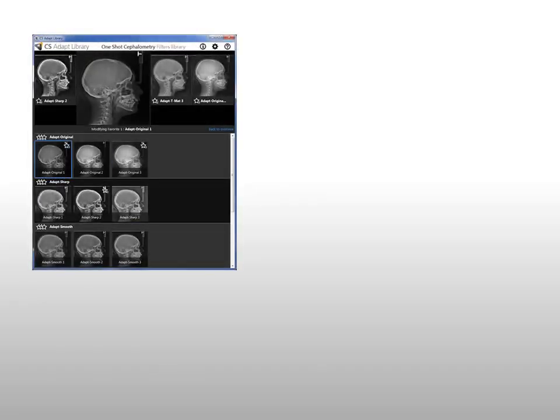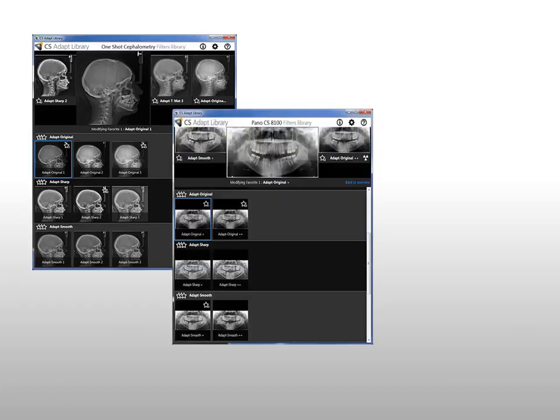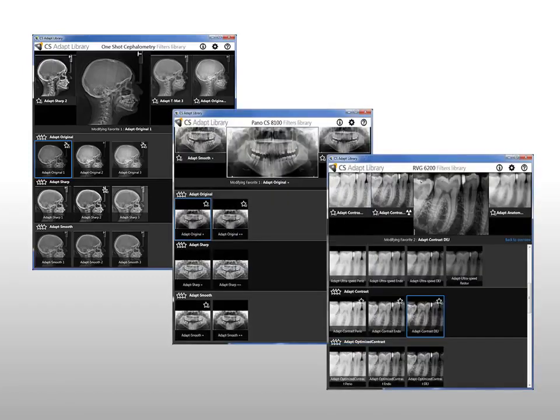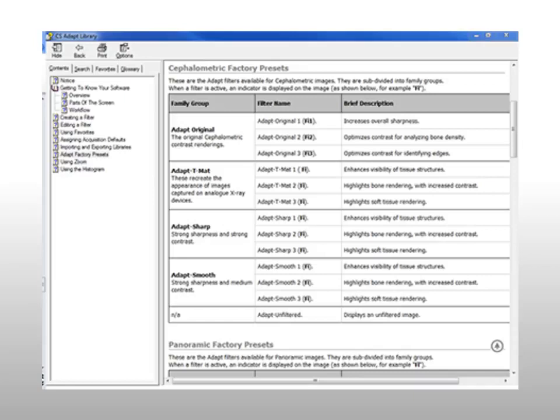Identify Library Filters. The filters available in the library are grouped according to image type. Each image type — Cephalometric, Panoramic, and RVG 6200 — has multiple groups of preset filters. See the CS ADAPT Library Help for detailed information on the filters.